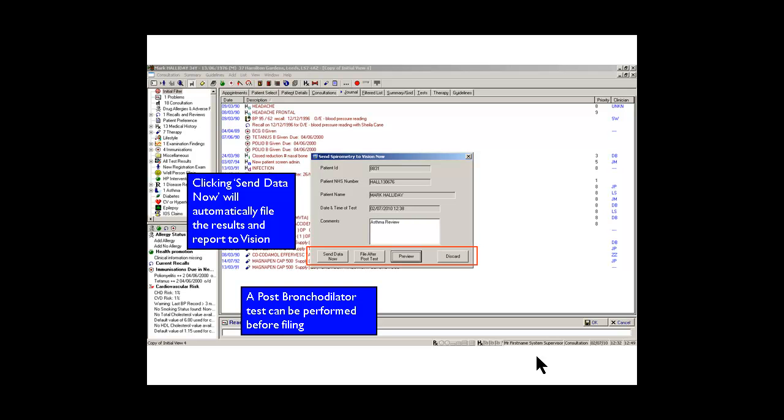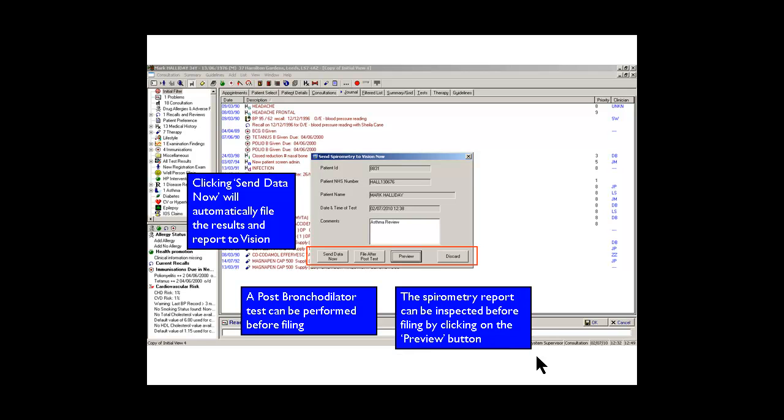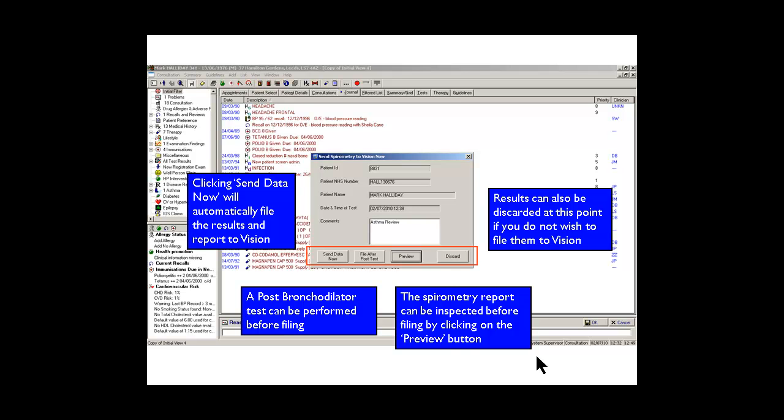We would file the results in one lump after they've done the post test. We can also preview the spirometry report as the PDF at this point if you wished. And we can discard them if we didn't want to place them onto the record for some reason.